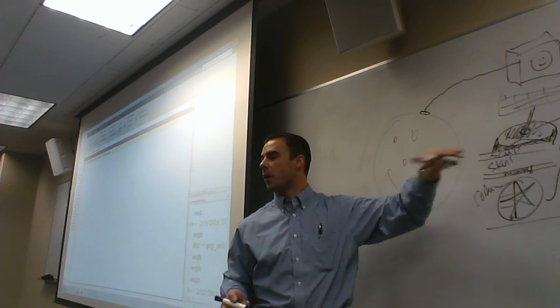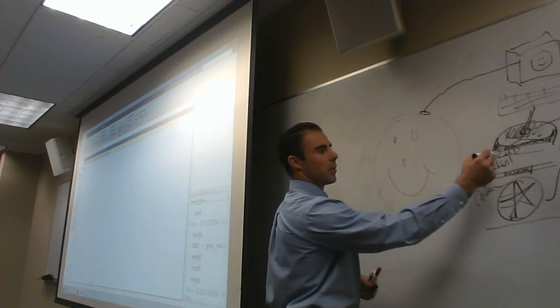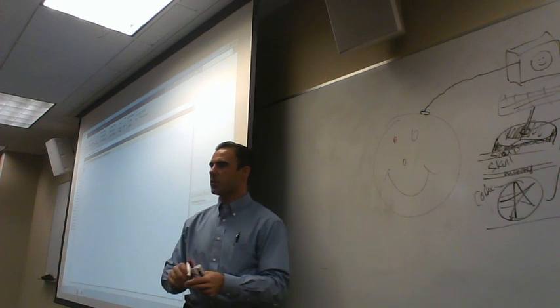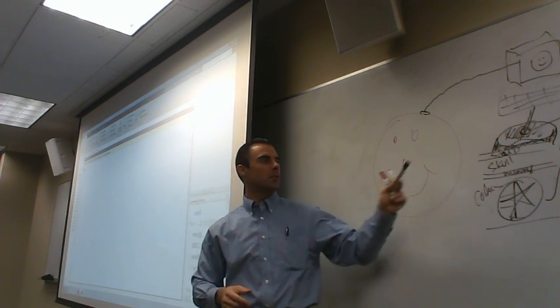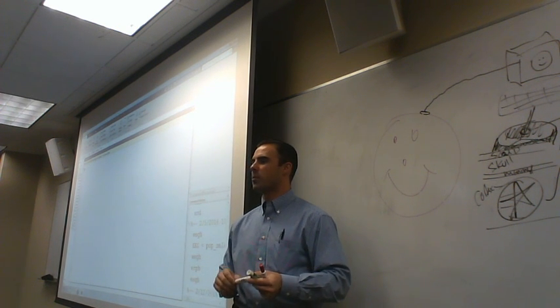Okay? And then, this is the scalp here, right? Now, ladies usually get this answer before the men do. What do we want to do to the scalp to help clean it up and make a better connection?